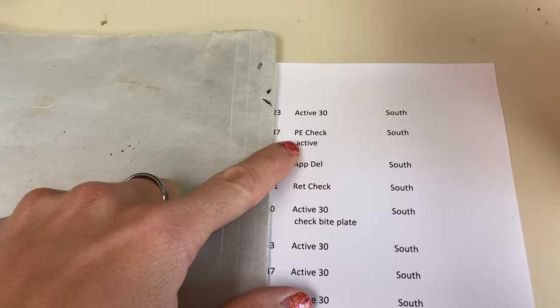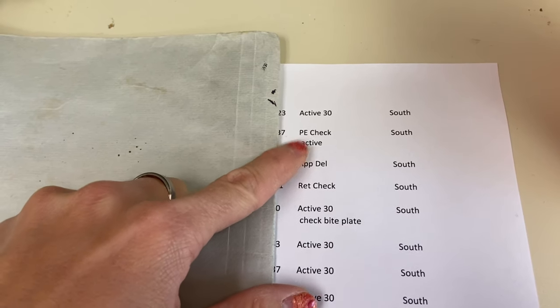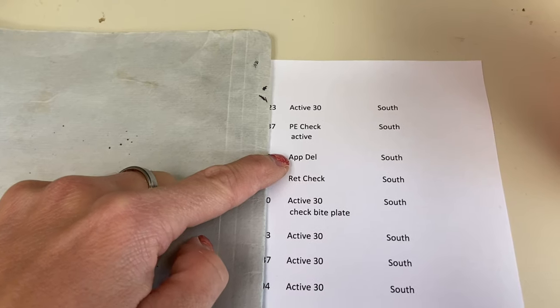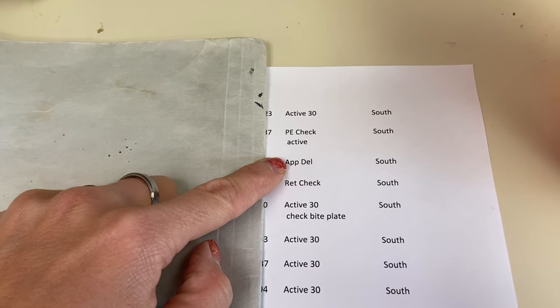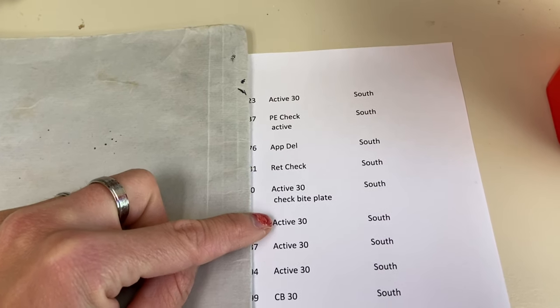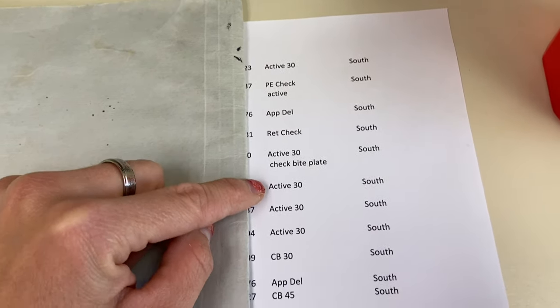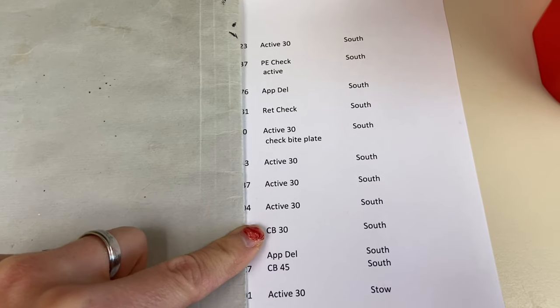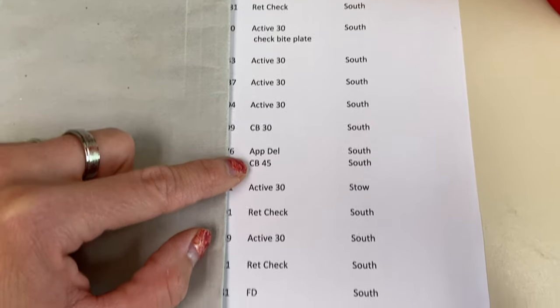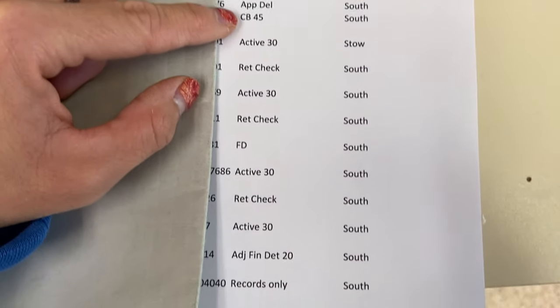We have to check an expansion on a palatal expander and they're active. We have appliance delivery — we have to deliver a retainer, a retainer check, cement bands, molar bands, appliance delivery, and molar bands.